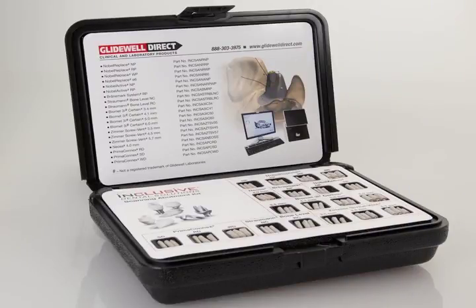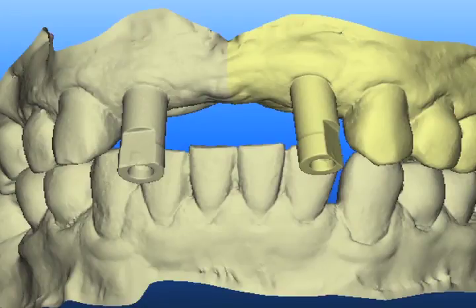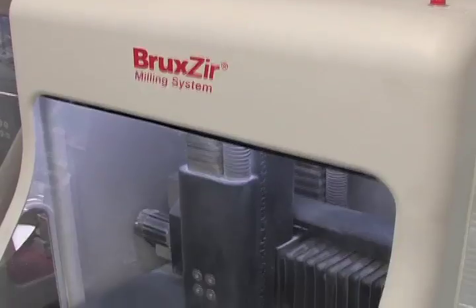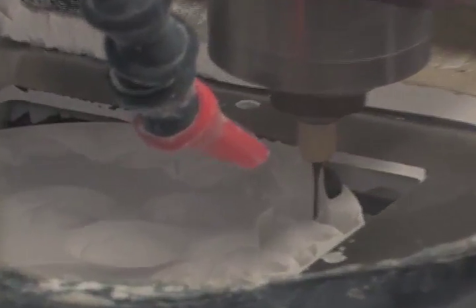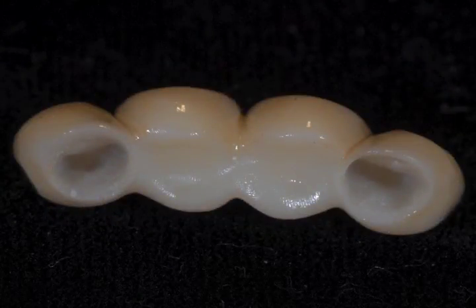We'll use a dedicated scannable abutment that comes from the Glidewell company and we'll use the CAD-CAM milled technology to create both abutments and a final four-unit bridge. This case is really unusual because it's one of the first times we've been able to carry technology from a scannable dedicated abutment to a final solution with zirconium abutments as well as a final four-unit bridge. The bridge will be a Bruxer bridge. We've done many of those in our office but we've never done one before where all of the technology was done model-less.